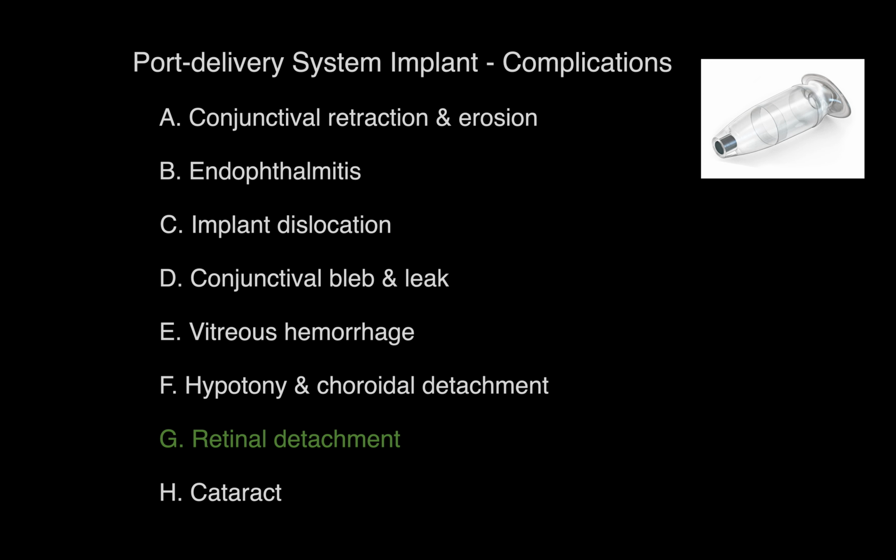Retinal detachment may occur with PDS implant. Management is surgery and technique may be at surgeon's discretion. And lastly, cataract. Its formation or progression was observed in the PDS trials. Surgery may be performed with usual techniques, with special attention to a clear cornea incision.